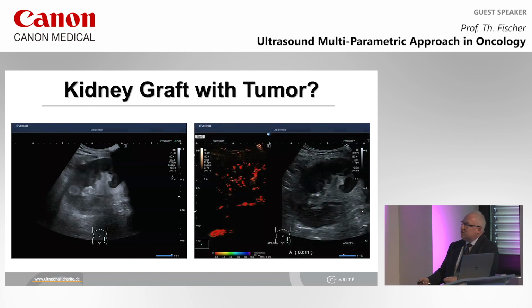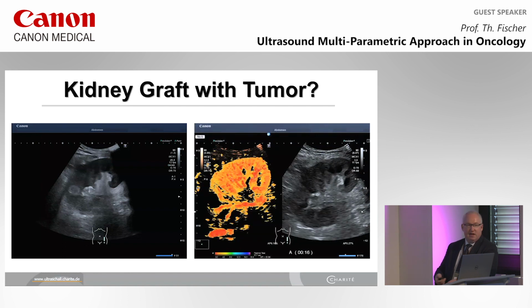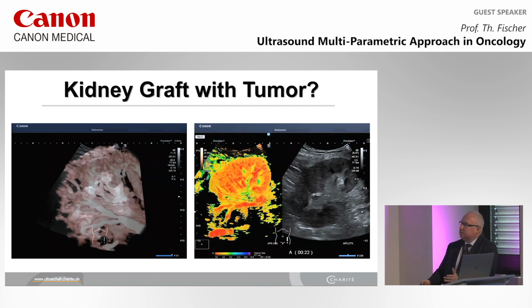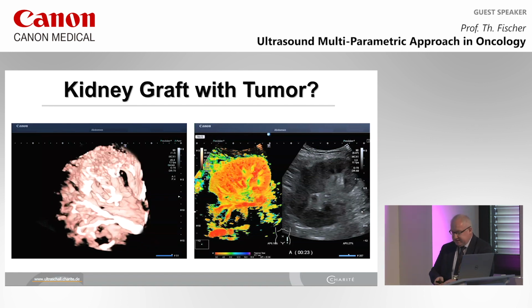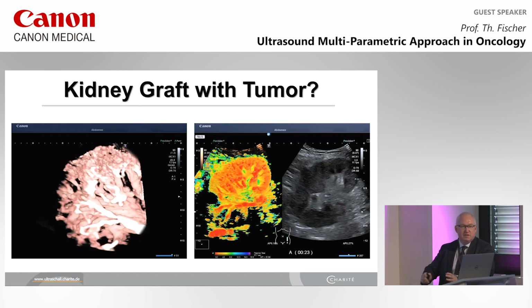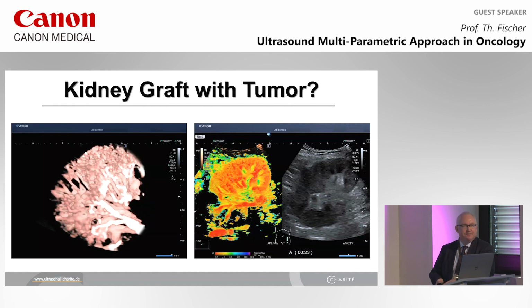So the idea was to use contrast. And look at this, after 14 seconds, I can say everything's okay. There's a complete absence of vascularity. Whatever happens, it's no problem for you. And I get in touch with this 3D reconstruction, nice images. And 5 days later, the surgeon told me, Thomas, this was a sclerosing cyst, so everything is fine. Good news for the patient, and of course, a good case for me.